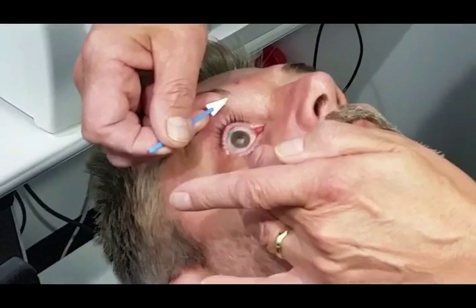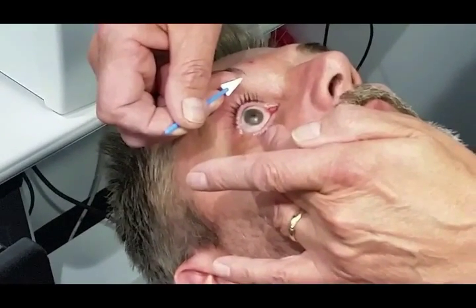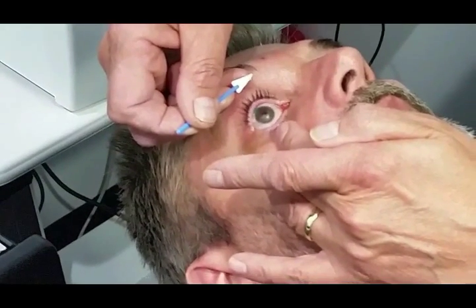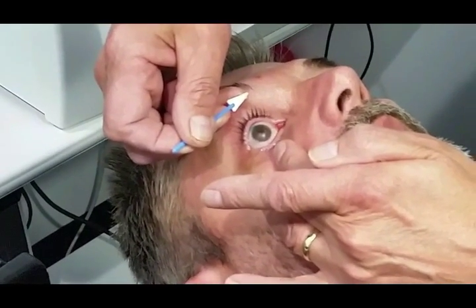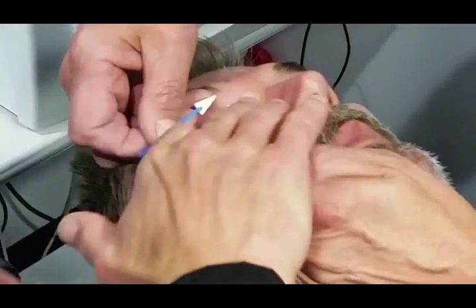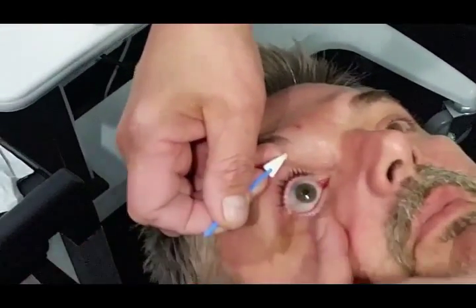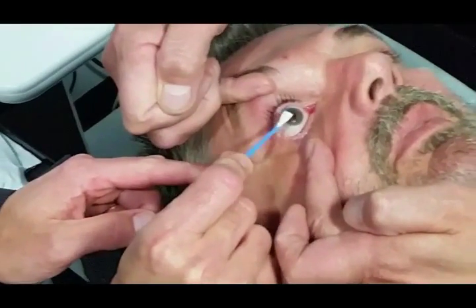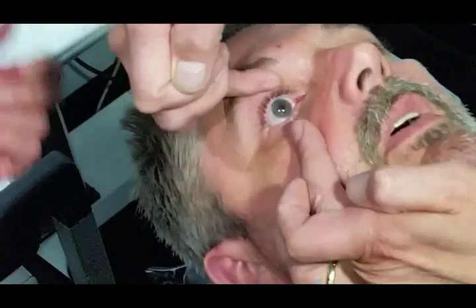Here comes the contact lens. We're using — and we've had a lot of success with this particular bandage after experimenting with several — a TrueEye by Johnson and Johnson. It's a TrueEye one-day lens, but we've had a lot of success using it off-label as a bandage contact lens.